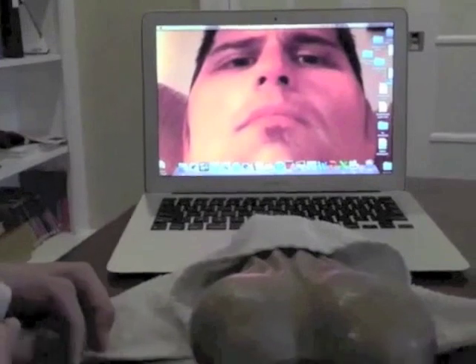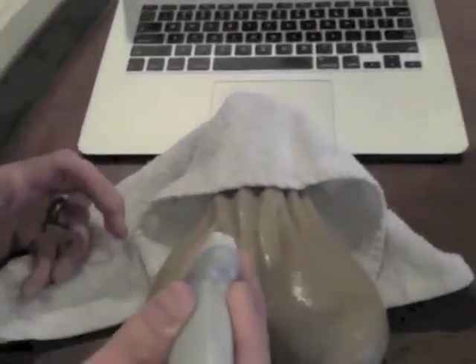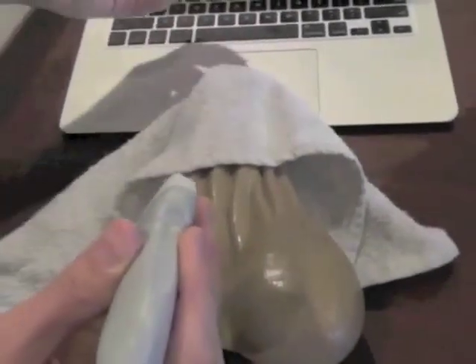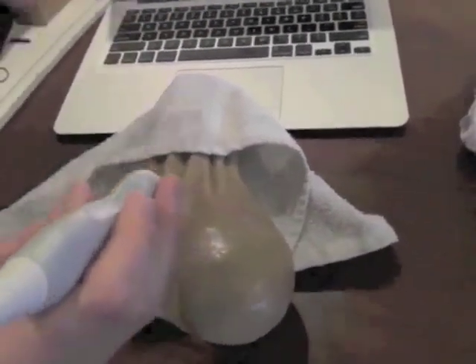So, with ultrasound of the testicles, it's the same as any ultrasound modality. You want to have a system, you want to do it the same way every time so you're consistent and don't miss anything. So, we're going to demonstrate on the model here. We try to find a lifelike model, but all we have are these miniature ones, so we'll have to demonstrate on that. So, the first thing, as we mentioned, is patient positioning. You want to take the penis, fold it up onto the abdomen, the chest, throw it over the shoulder, whatever you need to do. Get it out of the way, put a towel over it.